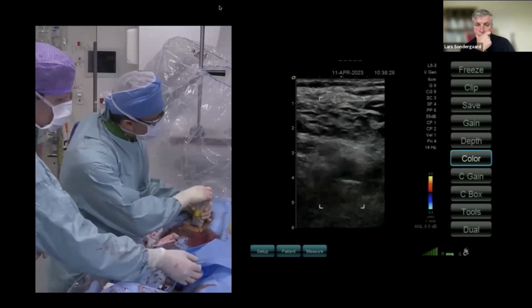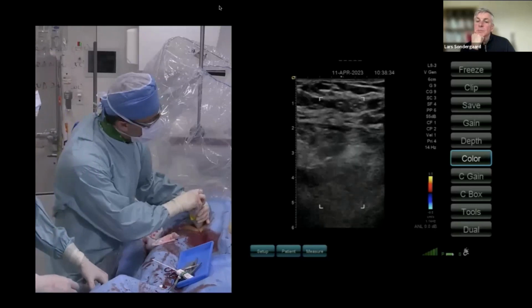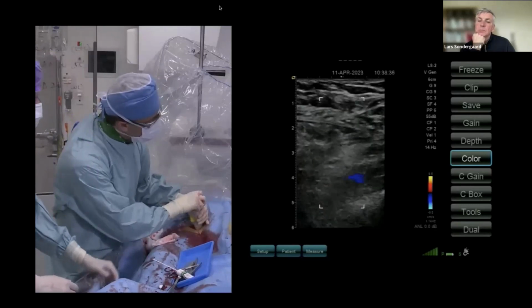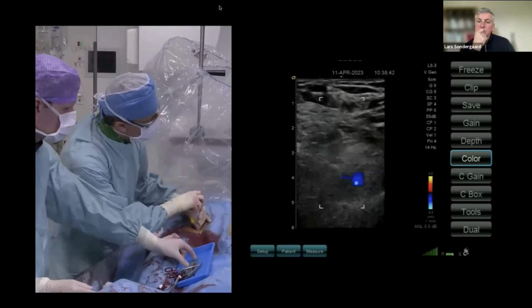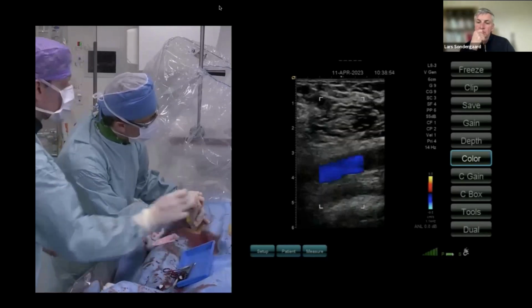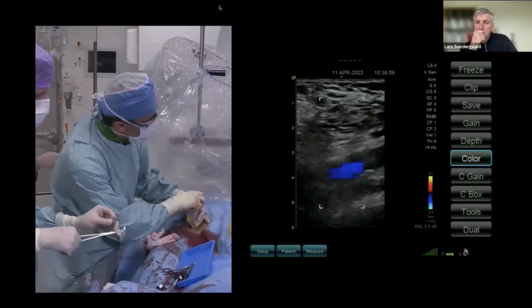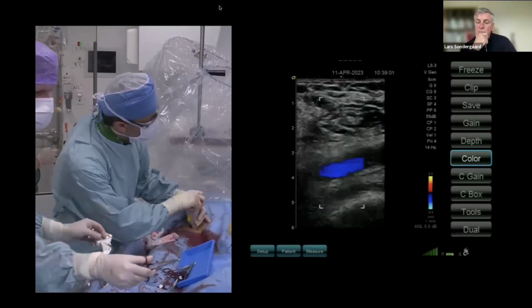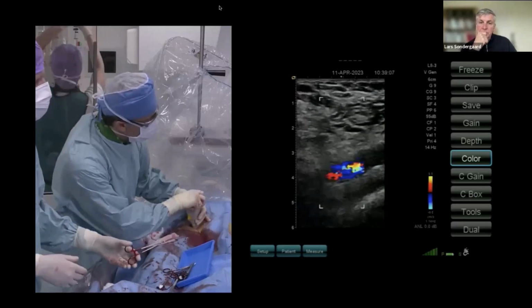Of course, I could go in the long axis as well. It's also possible to show, but of course, due to BMI more than 30, it's sometimes a bit tricky to properly align the whole vessel. And I also think the plug also gives some shadowing just where it's okay. It's a nicely pulsatile flow that we can see throughout its entire length in the groin region where we had access. So no visible extravasation and no visible occlusion to be seen.